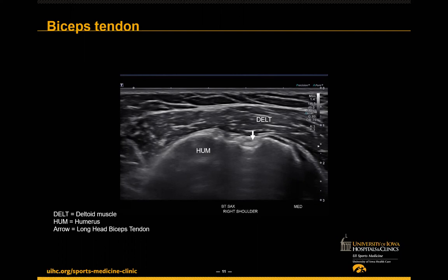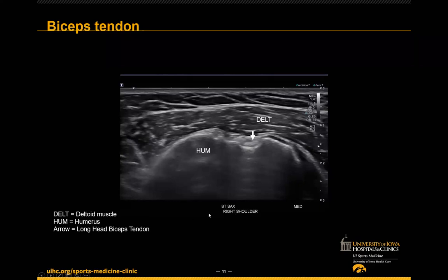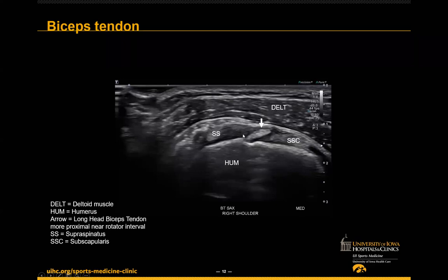I always start at the biceps tendon with the patient lying down, head of bed up slightly, palm supinated, orienting off the bicipital groove. We can see the biceps tendon sitting in the groove with bony morphology clearly delineated — looks pretty normal, no sheath effusion. I have everything labeled for teaching purposes, but typically I wouldn't label to this degree. I then follow the biceps up higher to get a view toward the intra-articular portion. If everything's normal, I get two short axis views: one in the groove and one up at the rotator interval.